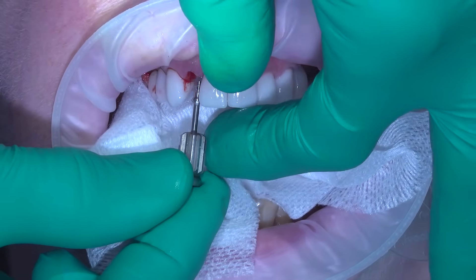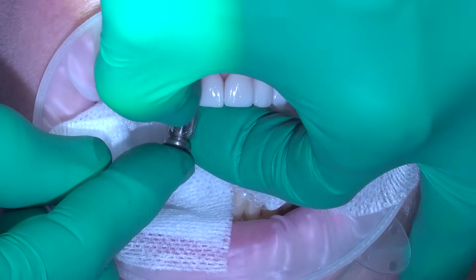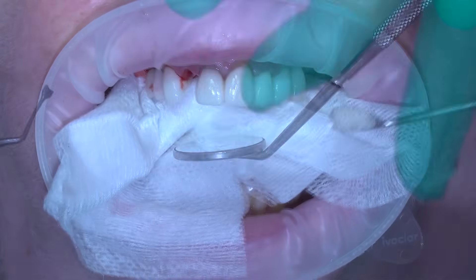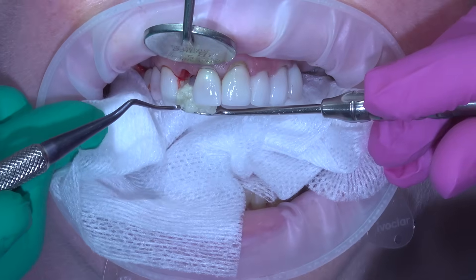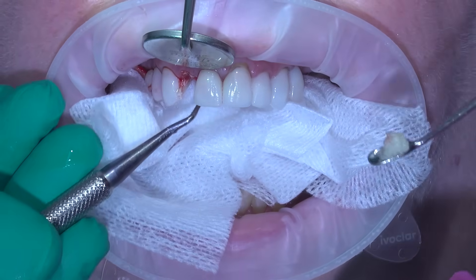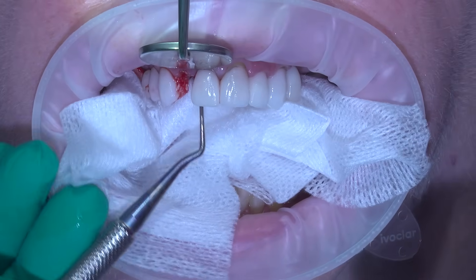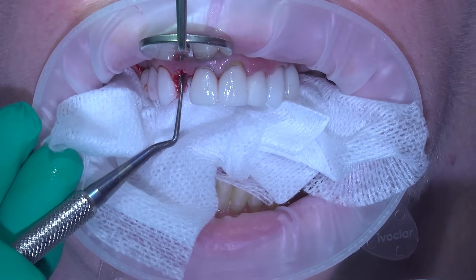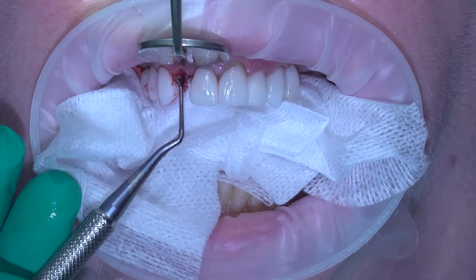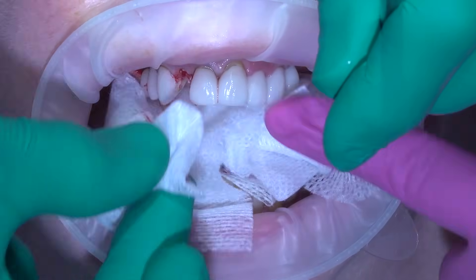Now we need to place the healing cap that comes inside the plastic container the implant comes in — it's complementary, comes with the kit. We put it inside the implant very lightly to block the inside, because now we're going to gap graft with some Mineross, which is corticocancellous chips. In this case we're using the curved pocket packer from Salvin. Each end has a different curve — it's a flat condenser like a spatula that lets you get into the little grooves around your implant between it and the bone. We don't need a lot because the lateral is small, so very little bone grafting is necessary here.